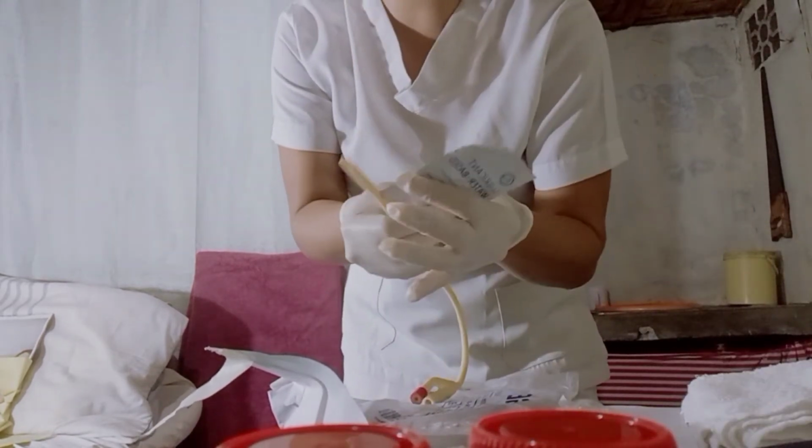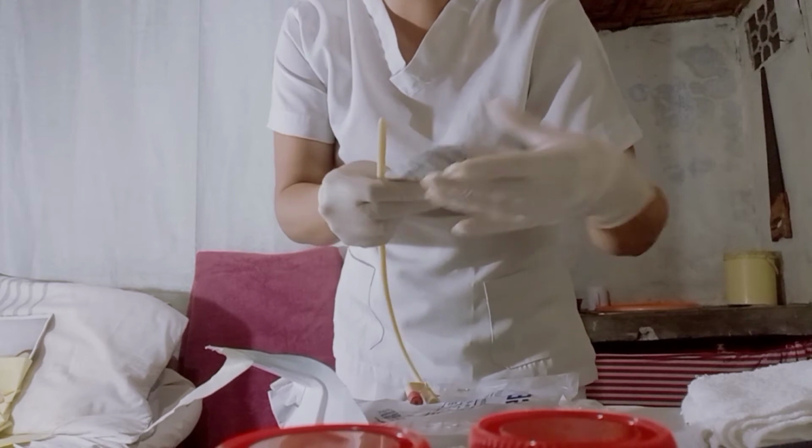It prevents local irritation of the meatus during catheter insertion and promotes insertion.